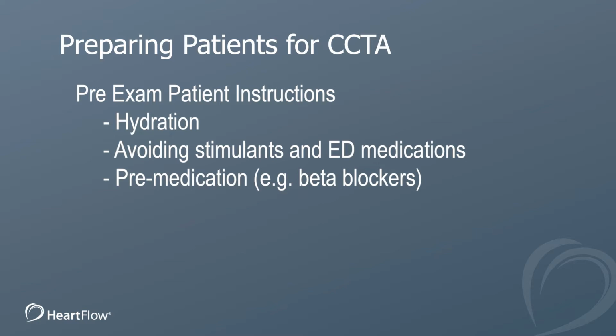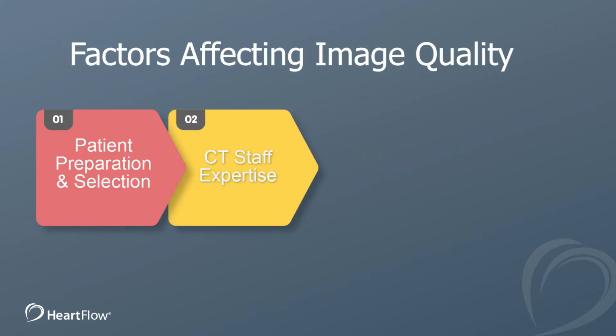We also can pre-medicate the patients with rate-lowering medications, sometimes the day before or morning of, or in a holding area with oral beta blocker. And these sometimes can be provided by a prescription or by samples from your office. What about CT staff and expertise?